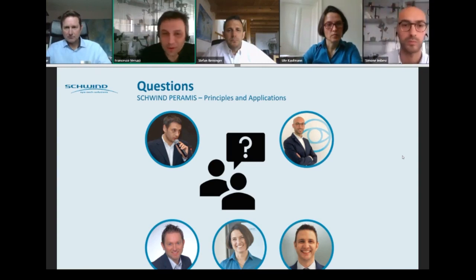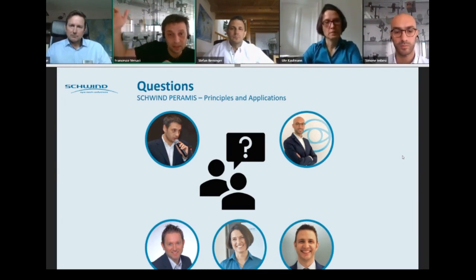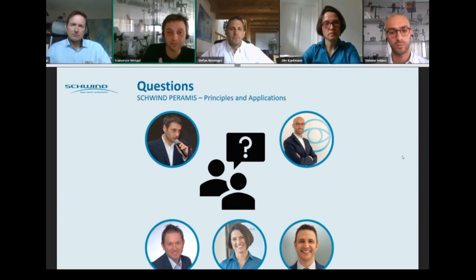I would need to go back to the presentation, but the optical design is such that everything is mixed up on the pyramid, but it is separated again on the CCD plane and on the pupil plane. So you have a mixture of rays in correspondence of the vertical pupil, but you can again split each component in this position when you are observing the 4 subpupils.